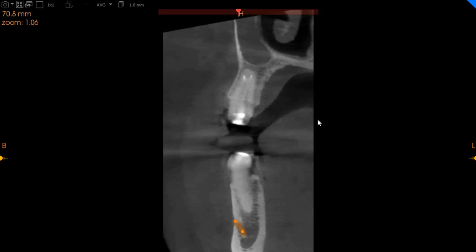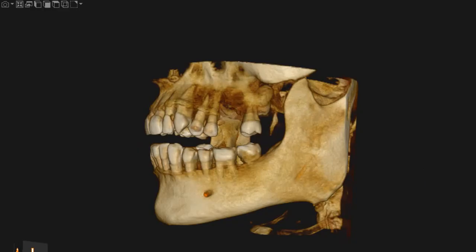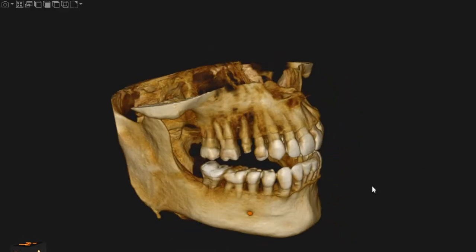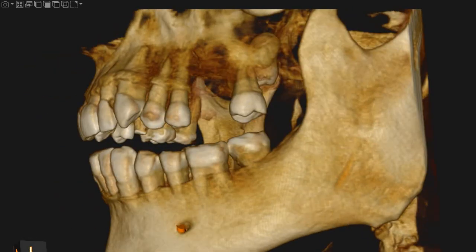But otherwise, the endodontal treatment looks appropriate and we do not know if there was a radiolucency present prior to the endodontal procedure or not. But we can see that this is where the radiolucency is. Moving to the upper left 6 region.